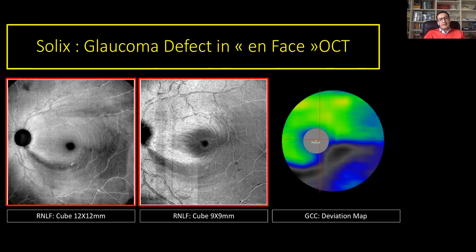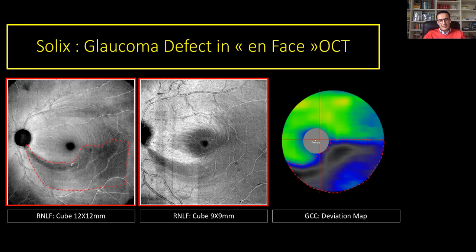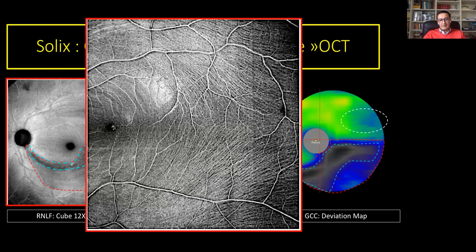You have to keep in mind the quality of EnFace OCT embedded with the OCTA pattern. In this case of a 12x12 cube, you can very well analyze the RNFL topography. In this case of glaucoma, you can analyze the degree of the defect as compared to the GCC deviation map, and you can make a very good correlation between structural function and visual field. In a normal case, the RNFL is very well delineated in EnFace OCT.